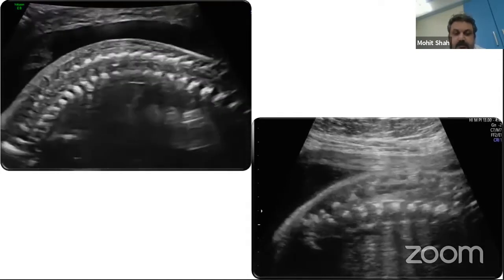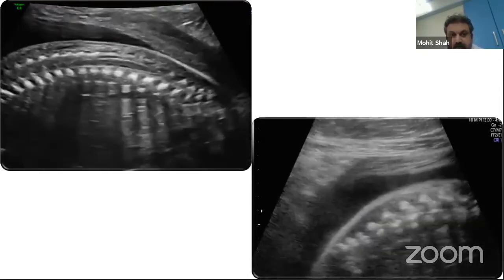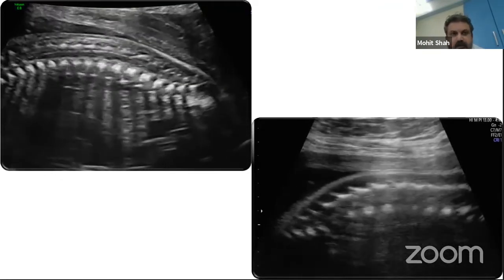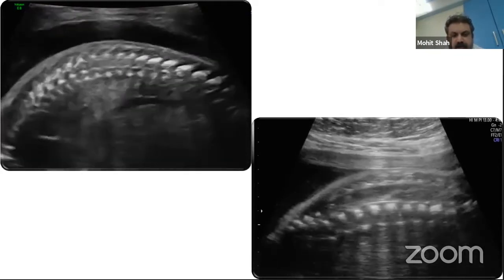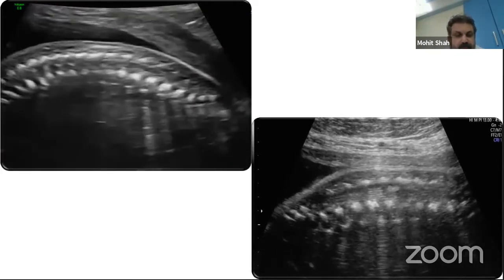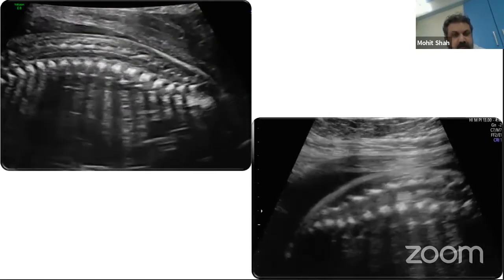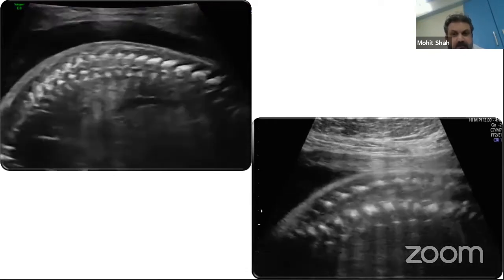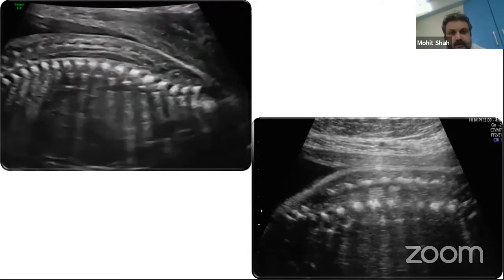But the real use comes when we deal with pathologies like meningomyelocele, tethered cords, where you see that the cord is low lying below L3 and tethered dorsally within the vertebral canal. And also you can see a fat component within the vertebral canal in cases of intraspinal lipomas. And these are the clear indications where high frequency will yield a more accurate diagnosis, Dr. Meenu.